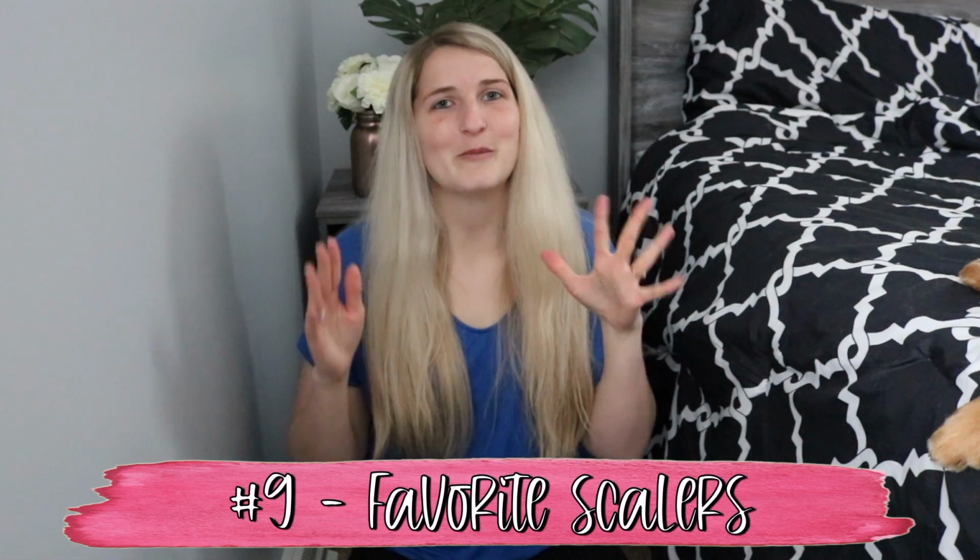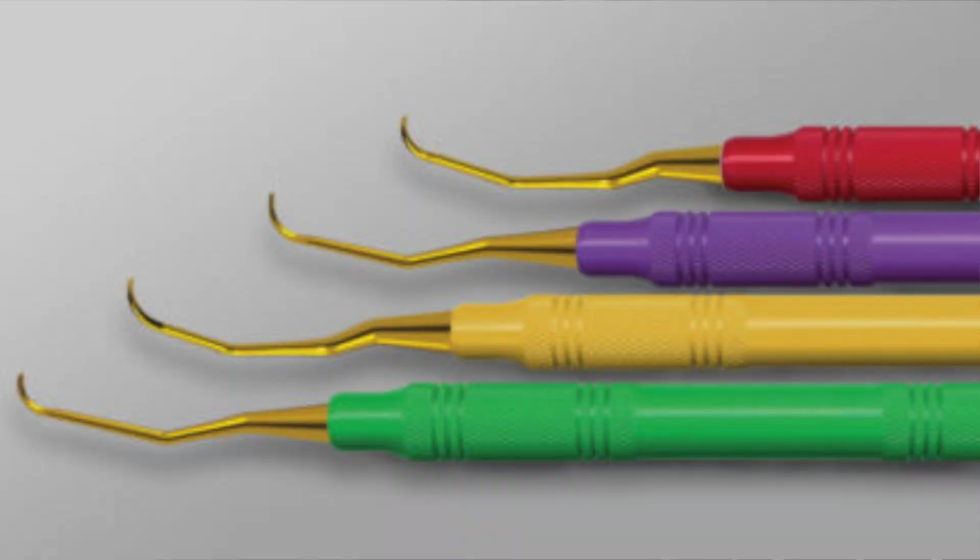Number 9 on my list is scalers. So I'm sure every dental hygienist watching this is dying to get to this part. We actually use the gold American Eagle instruments at our office and I love them. Some of my favorite American Eagle instruments are the Talon and the Claw. I actually always have one of each of these in every single packet that I have. And then some of my other favorite instruments are the Nevi, the 4R, 4L scaler, and a Gracey 1-2.